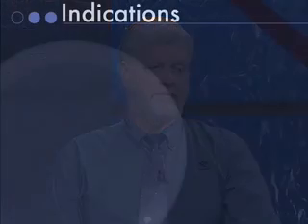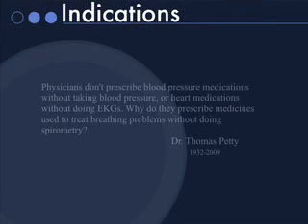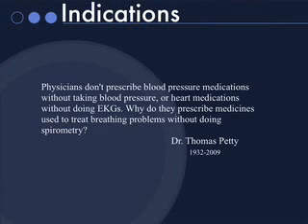What are the indications for spirometry? As Dr. Thomas Petty was fond of saying, physicians don't prescribe blood pressure medications without taking blood pressure, or heart medications without doing EKGs. Why do they prescribe medicines used to treat breathing problems without doing spirometry?